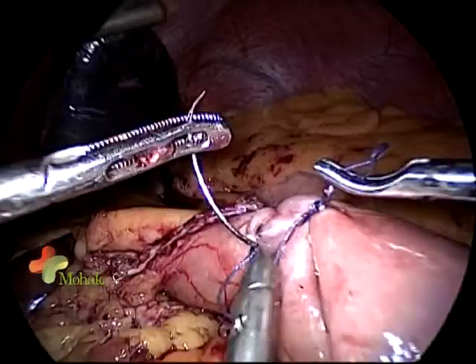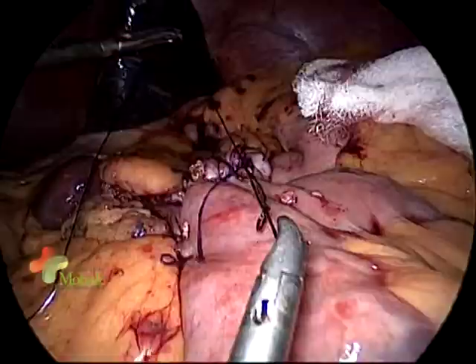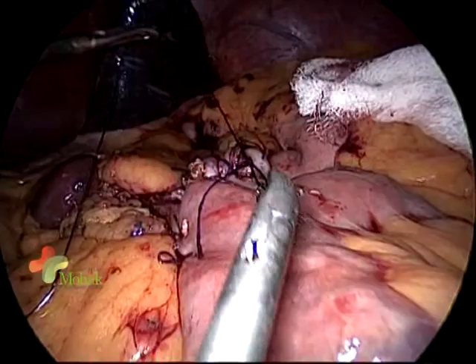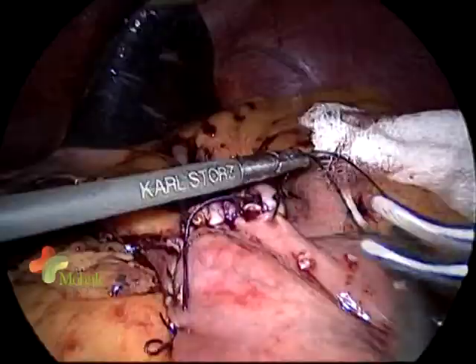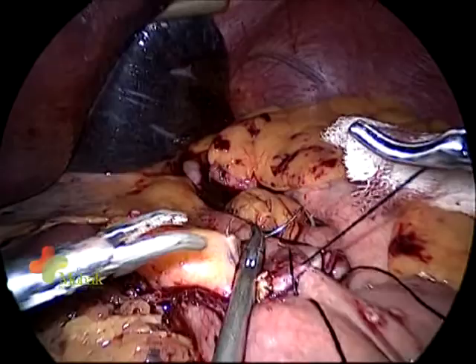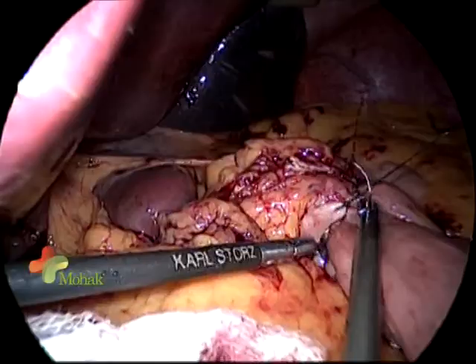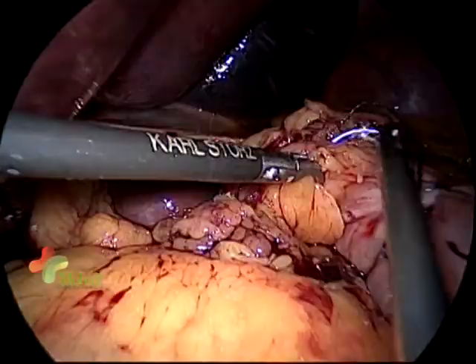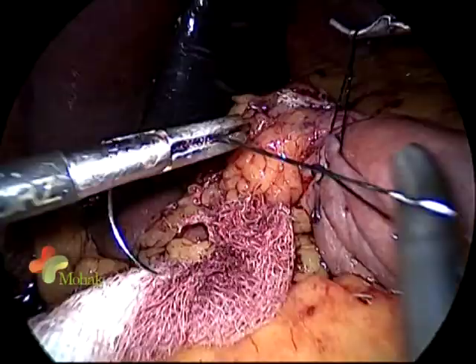There is also a lower incidence of nausea and vomiting in these patients once the gastric calibration tube has been passed. You can pass the GCT after the first layer, but forcing it unnecessarily may cut through the stitches. The second layer is taken with silk to bury the Vicryl layer. We always try to avoid the major vessels at the lesser curvature in the second layer, because if they bleed there will be a large hematoma near the pouch of the gastrojejunostomy.